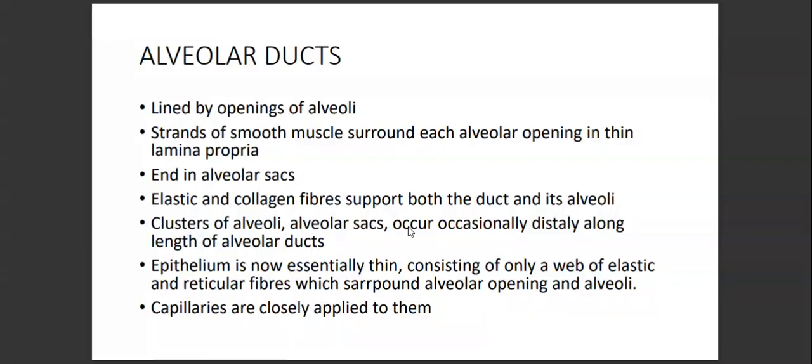I've already mentioned this point, but perhaps to emphasize one thing: clusters of alveolar sacs occur occasionally distally along the length of alveolar ducts. These are not so many, but they occur at irregular intervals, especially distally along the length of these alveolar ducts.